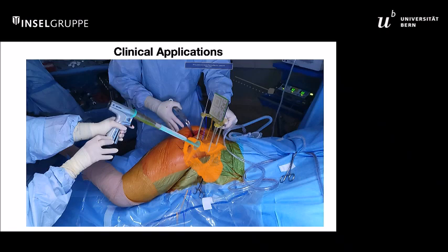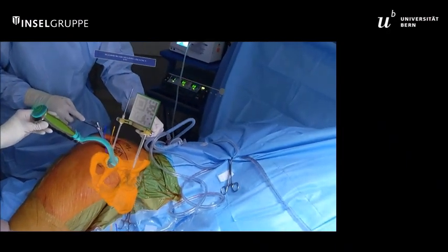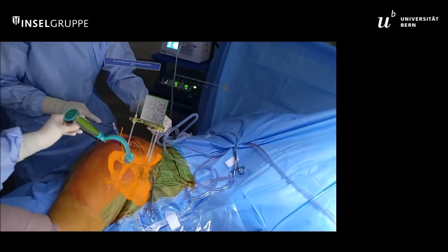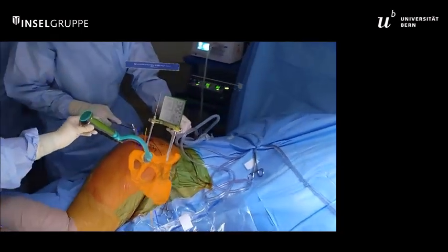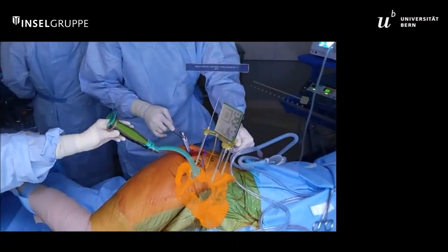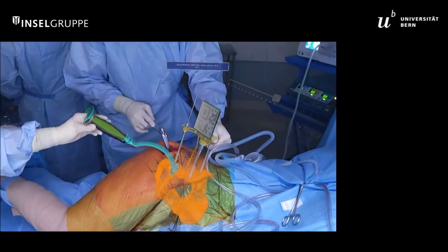In terms of clinical applications, this shows displaying a reamer being used in surgery. There's typical routine cup placement where you project the pelvis, the tool, the cup impactor, and the cup. And we don't actually track the cup impactor. You just display to the surgeon where they should put the cup impactor, and they line it up and insert it.